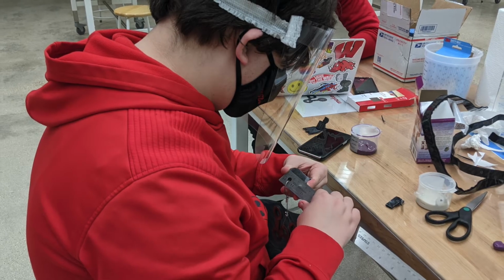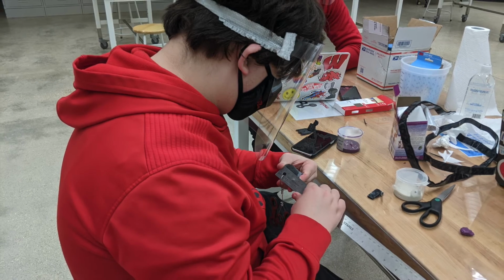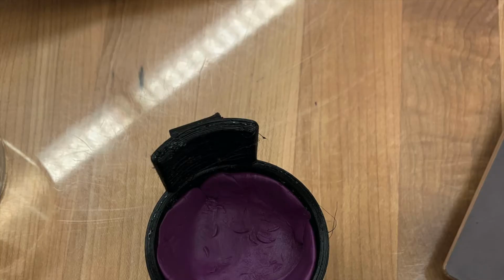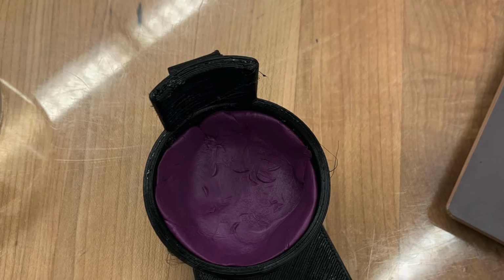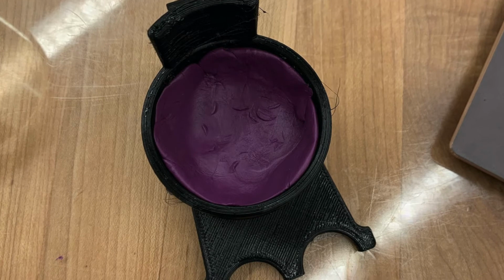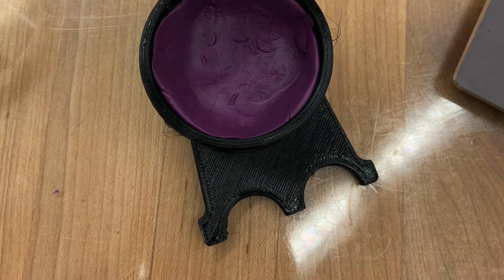After our design was printed, we then got to work on assembling the prosthetic, which meant we had to create a 2-part silicone which would go within the prosthetic's basin to help alleviate any abrasion or discomfort that might come to Peg from that hard plastic. We wanted to use this preliminary design to not only test whether or not that material is going to do well for Peg in terms of the TPU, but also how to create that silicone efficiently and if it would stay within the prosthetic and not get displaced.